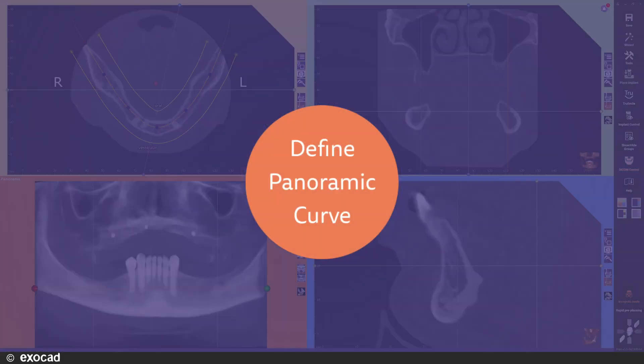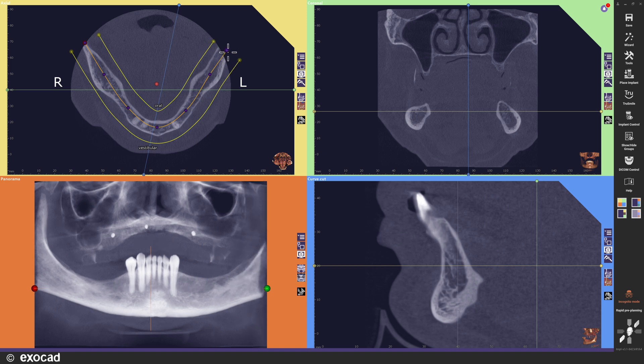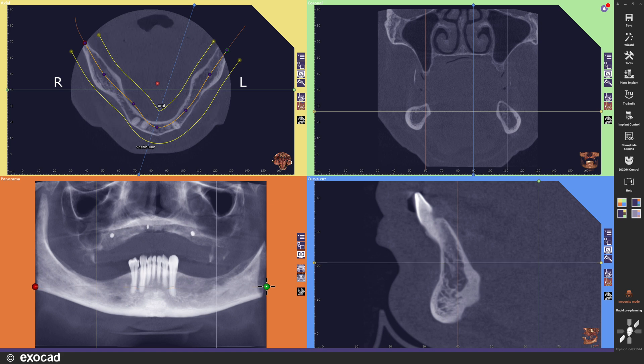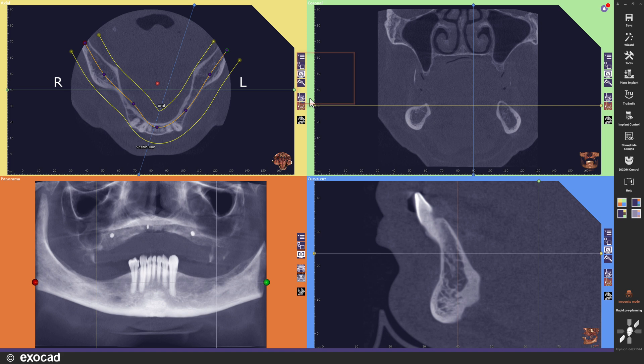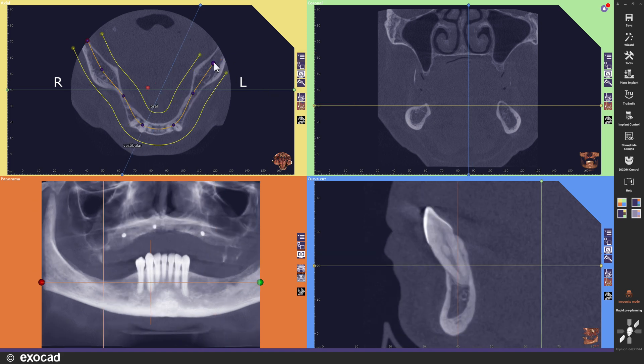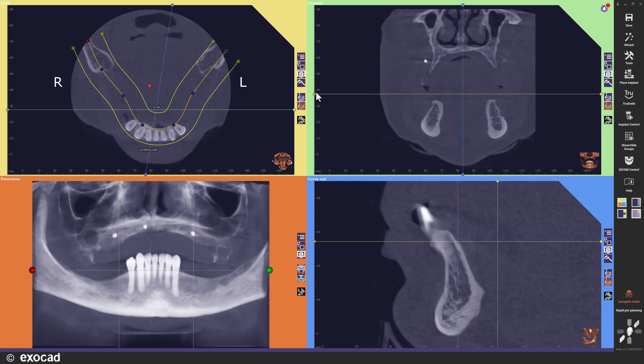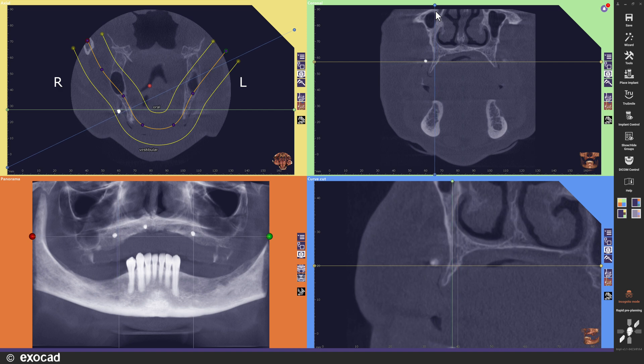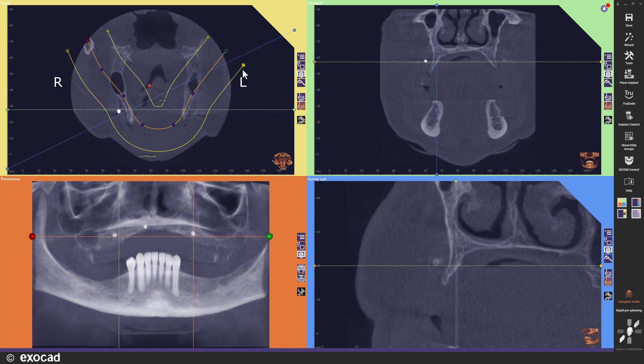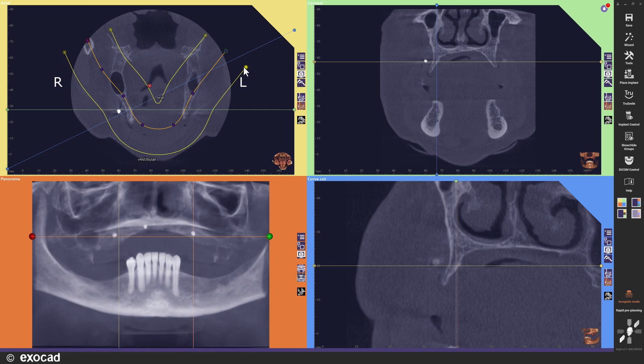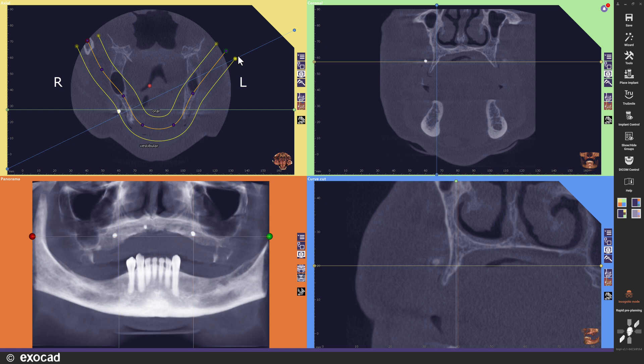This is the default view arrangement for the Rapid Preplanning mode. In the Axial view, the panoramic curve is automatically detected at start. As always, I can also define it manually if I want. The automatic curve detection can be activated again in the Axial view menu. I use the intersection markers to orient through the data and find the area of interest. In this version, it is possible to define the depth of the panoramic view with these control points.